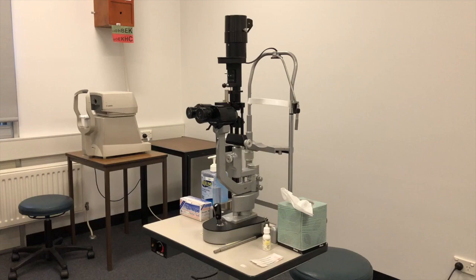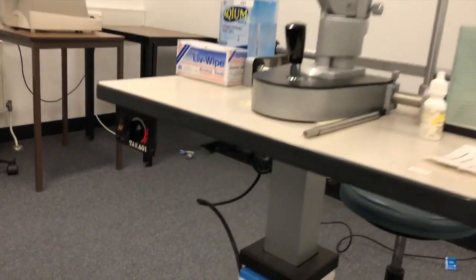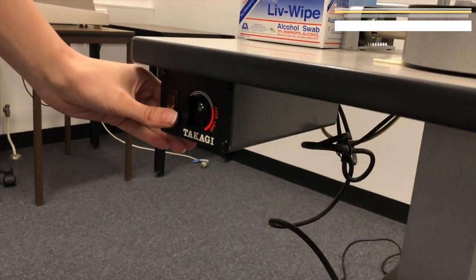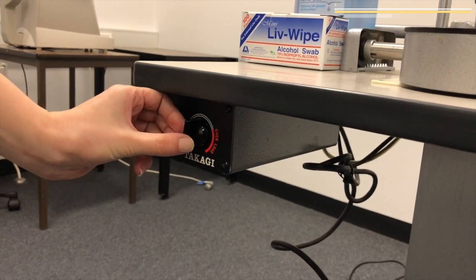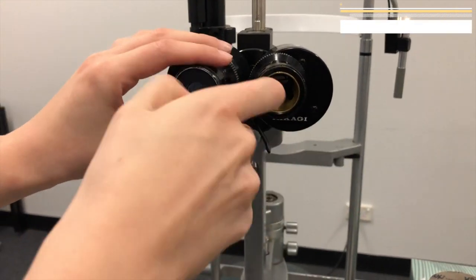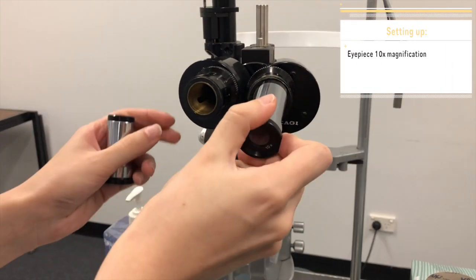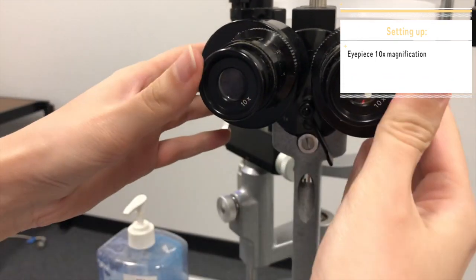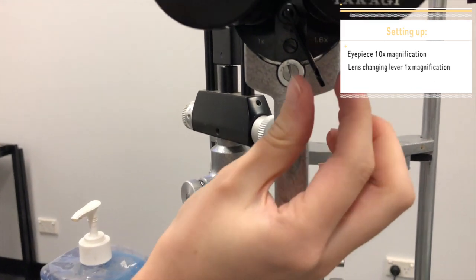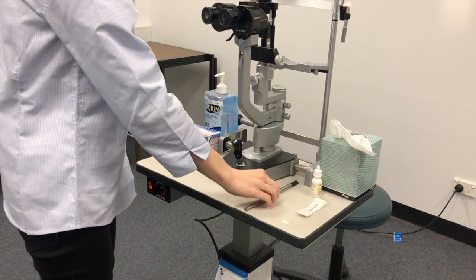Here is a demonstration of a slit lamp setup and the testing of a patient's tear breakup time. Firstly, the examiner turns on the slit lamp and switches its setting to full illumination. Then the examiner will place in the eyepieces that are of 10 times magnification. Then they will make sure that the lens changing lever is at 1 times magnification.